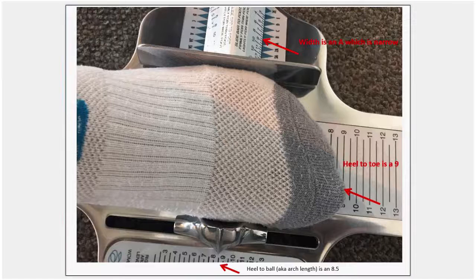So on closer inspection, you can see Joanne has properly lined up all the measurements. And Helen's heel to toe size is a 9. So if you look at that heel to toe, you go up to the right-hand side, the width, you follow 9 from the heel to toe size to the letter measurements. And Helen's width on her left foot is an A, which is narrow. Remember, on women, B is the regular width. On men, D is the regular width.